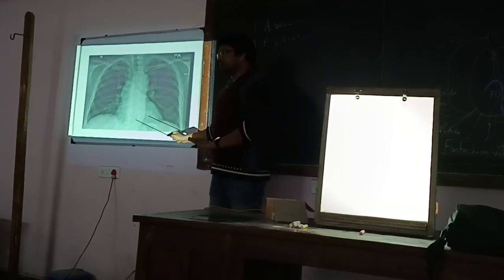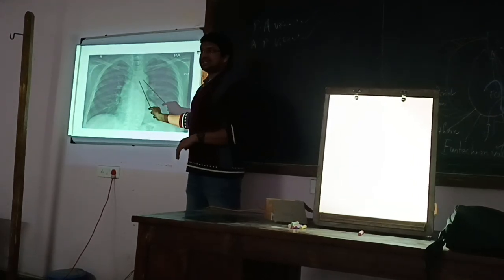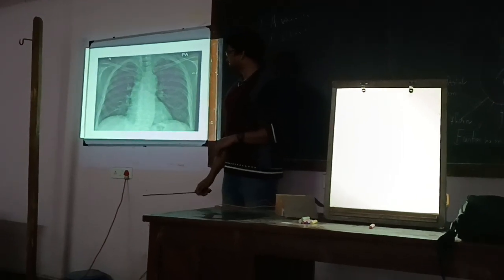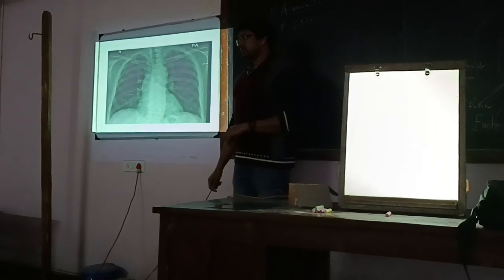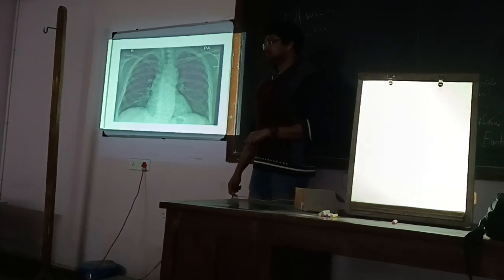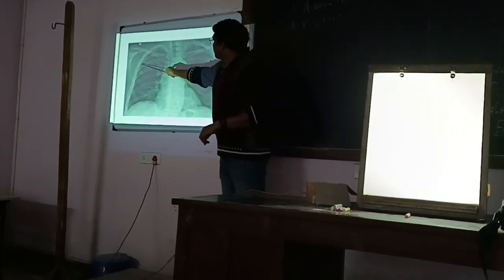If any dye is used, so that the blood vessels or any other structure get filled up with the dye, we can see the passage of the dye.